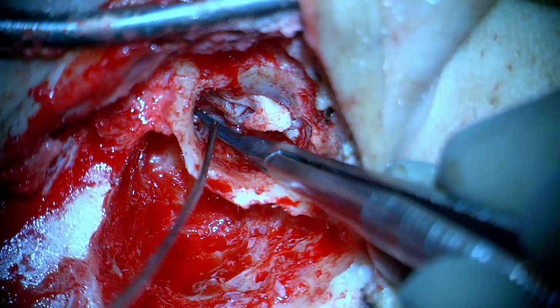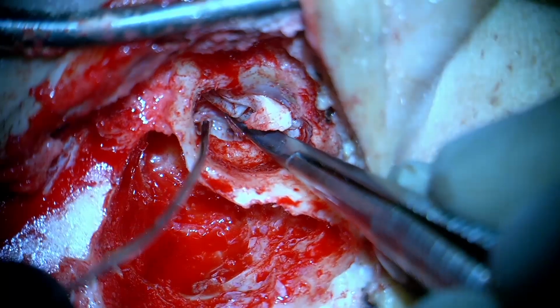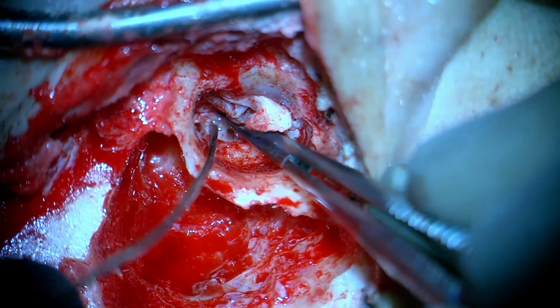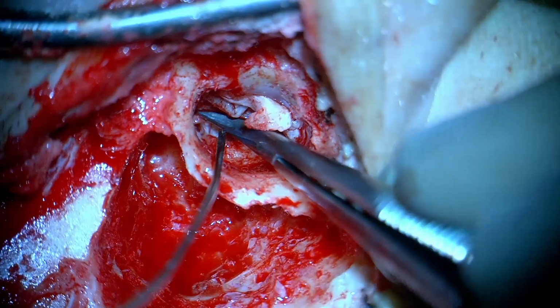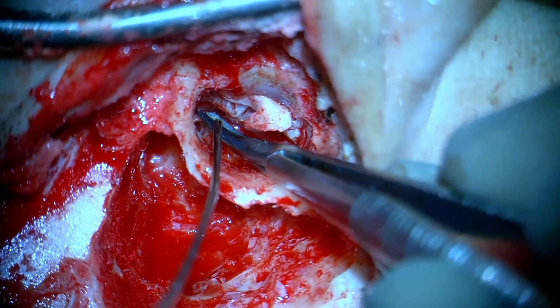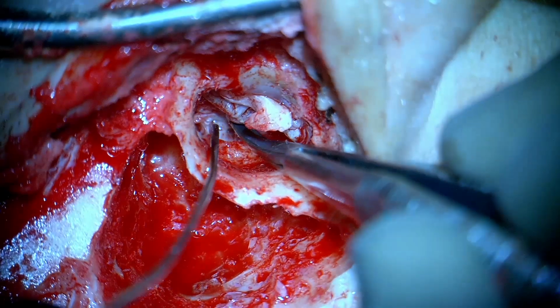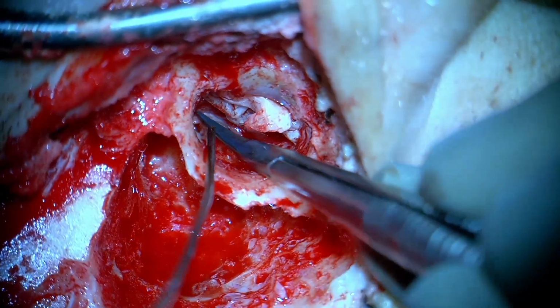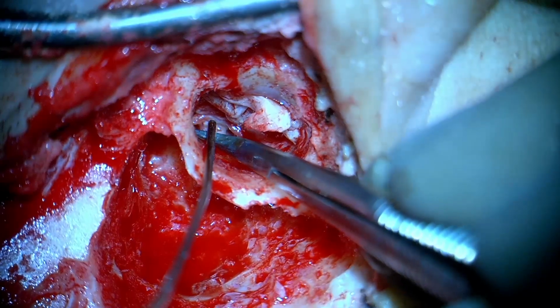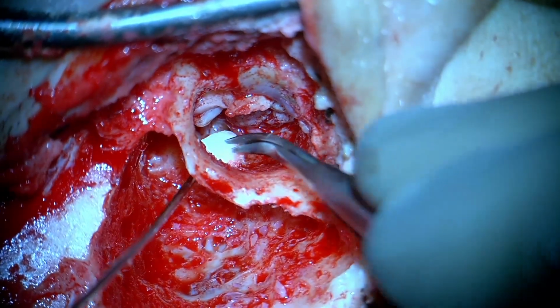And now we're just clearing the last bits of diseased mucosa from the long process of incus, which still has contact with the stapedial capitulum's head, even with some erosion. So we would not want to remove this incus because it is still conducting. And we hope that with disease removal and placement of a cartilage graft, the incudostapedial joint's intact status would be preserved in the future as well.